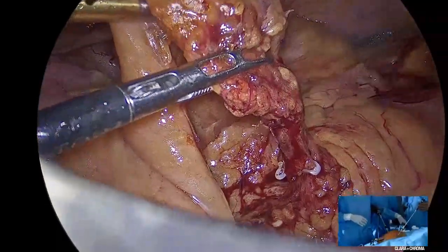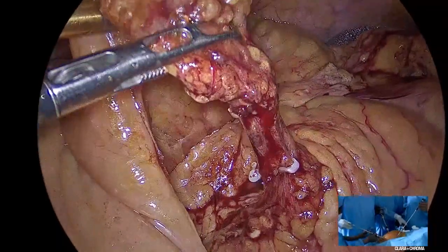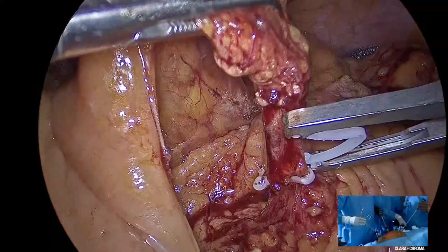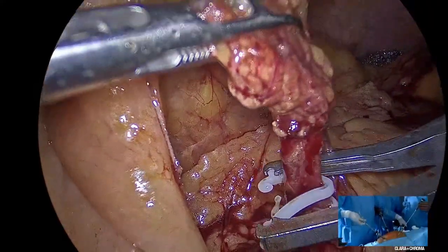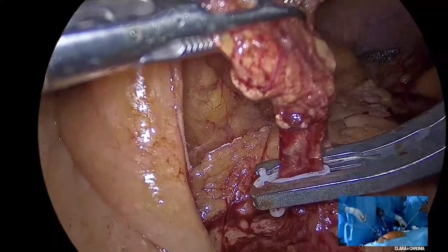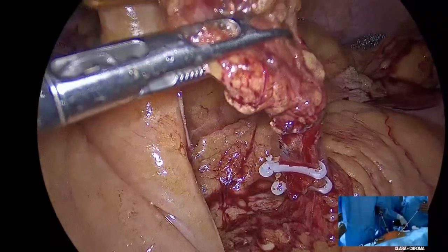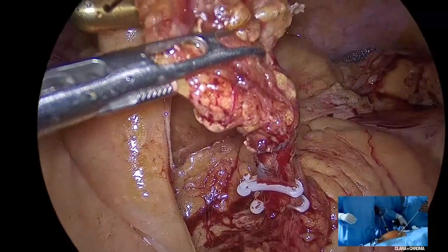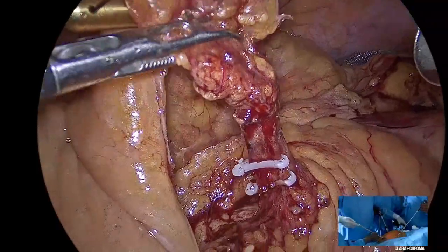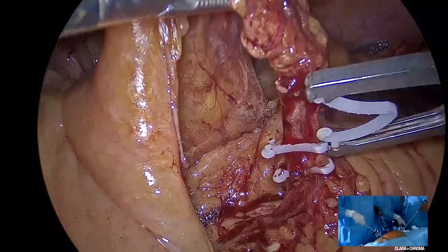So just for the benefit of the audience, if you think you can get the artery and vein separately, go for it. But you don't always have to do it that way, because as I told you earlier, in these patients this maneuver might be quite difficult and possibly even dangerous. And if the artery retracts back, you're in for some trouble. So if you have a difficulty, you might as well take a white stapler, and staple right at the root. It's wonderful. But never clip them together. If you do it together, it has to be a stapler, not a clip.